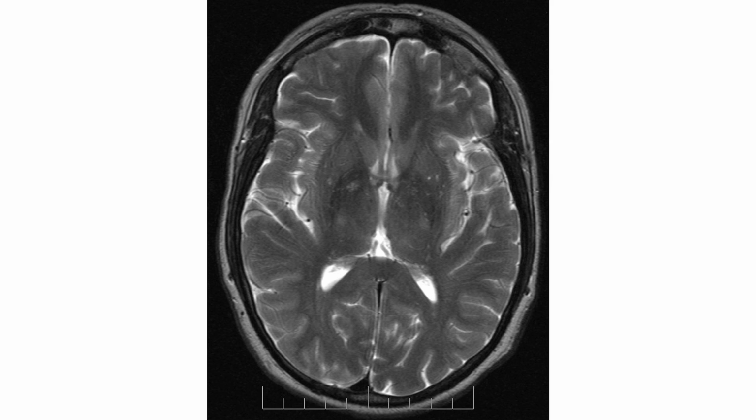The MRI sequences used look at the symmetry of brain water diffusion. Bundles of fiber tracts make the water diffuse asymmetrically in a tensor, the major axis parallel to the direction of the fibers. The asymmetry here is called anisotropy. There is a direct relationship between the number of fibers and the degree of anisotropy.